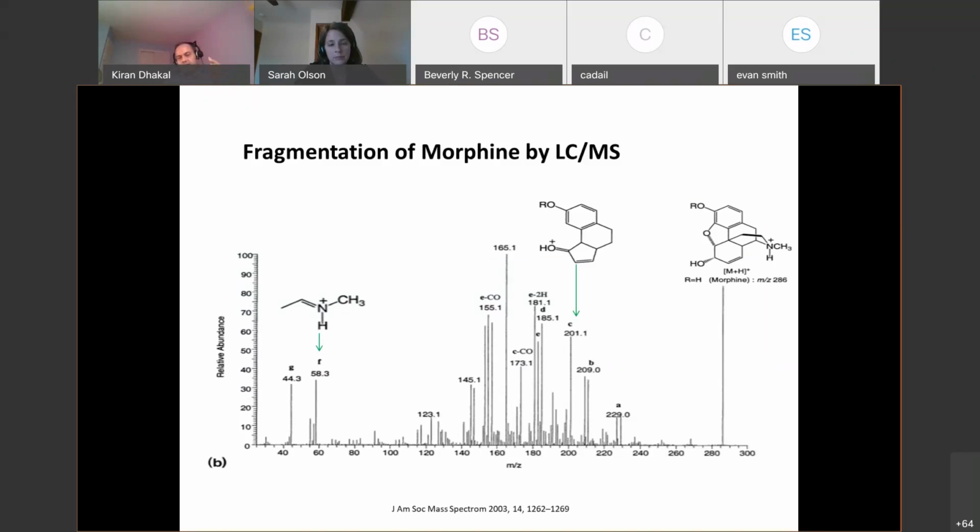And this is a kind of fingerprinting of that morphine molecule for this kind of mass spectrometry analysis. So every time you have morphine in your urine specimen, the instrument will see all these ions, and as we program the instrument, we'll pick certain ions out of it to quantify that this is the footprint of morphine.